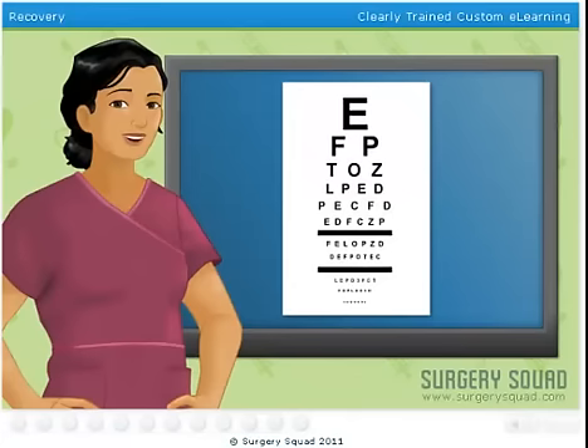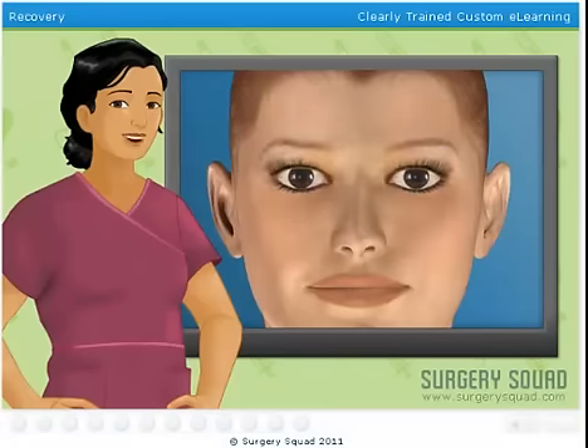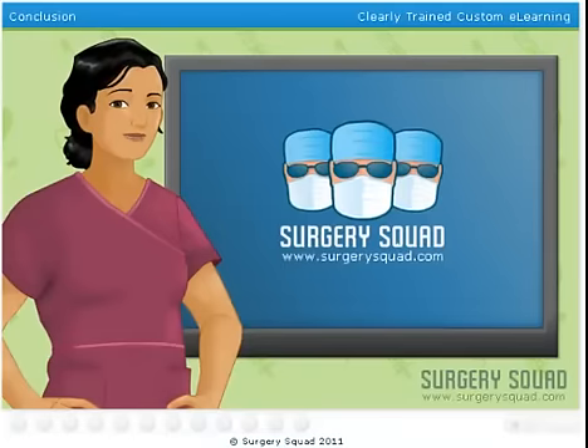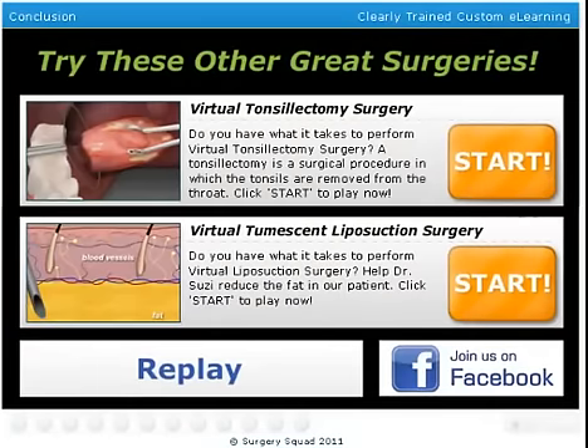She may now be driven home, as she won't be able to drive for a day or two. She'll come back within the next 48 hours so we can remove the eye shields, test her vision, and examine her eyes to make sure everything is healing up nicely. And there you have it — another successful surgery. You can see more of my superior surgical technique and other procedures here on SurgerySquad.com.